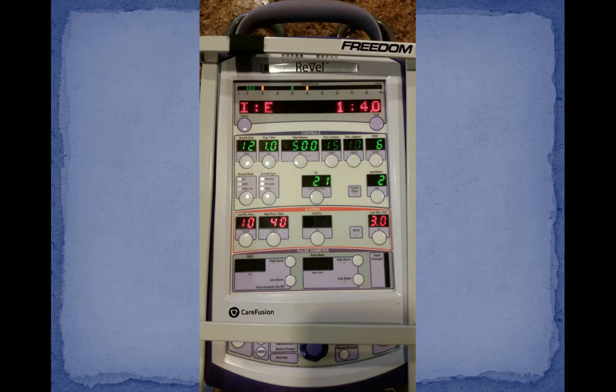Drop down a row and you'll notice the breath mode defaults to assist control with a breath type of volume-based ventilation. So all you have to do is take that breath mode and switch it to SIMV and lock it in. You'll notice that the Revel defaults to an oxygen of 21% FiO2, so you're going to have to titrate that up as well.